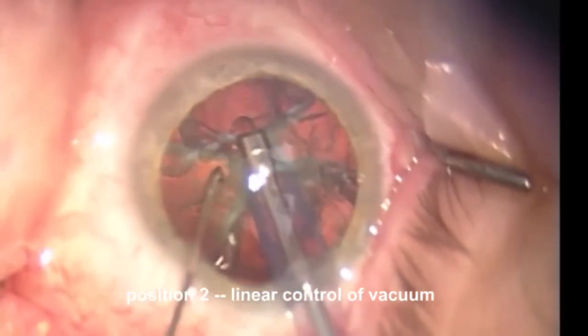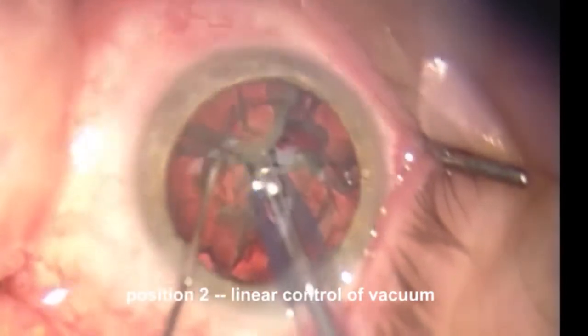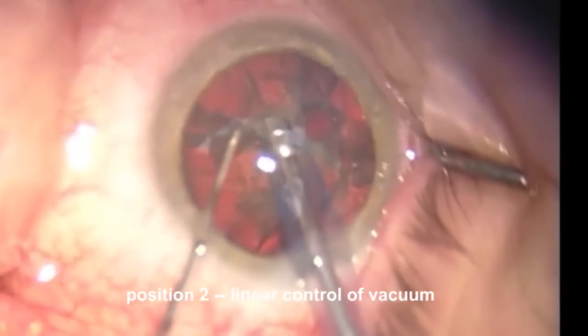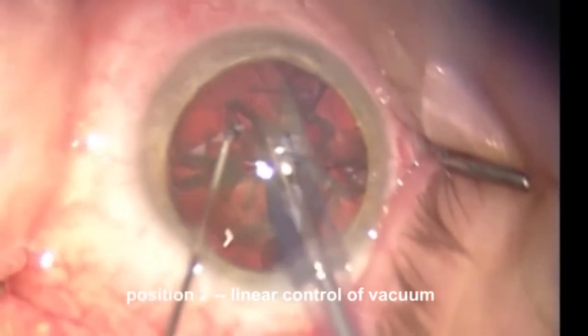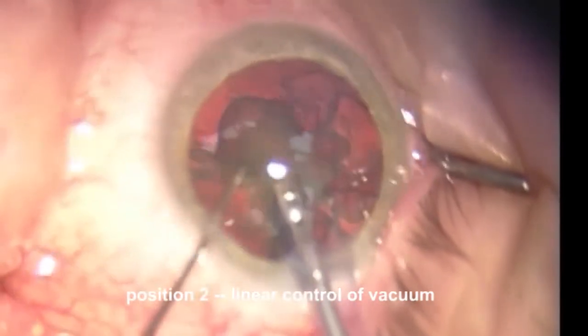We need very little actual ultrasound. Ozil is very useful for the small amount of resistance that these soft lenses will provide to the phaco needle, so I'll tend to use Ozil in this situation. It increases the followability.